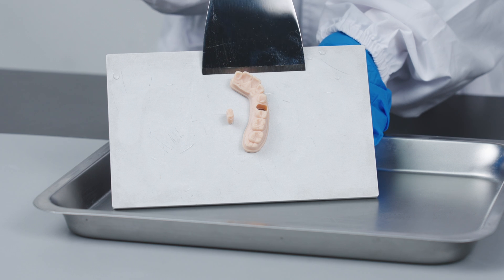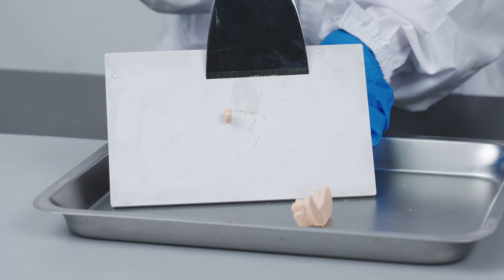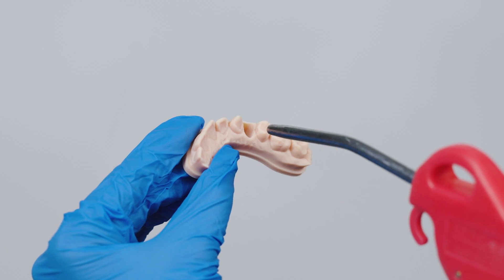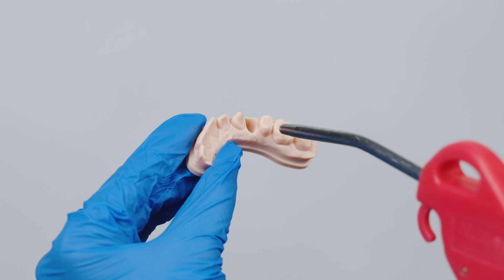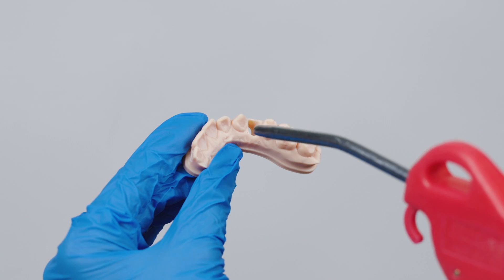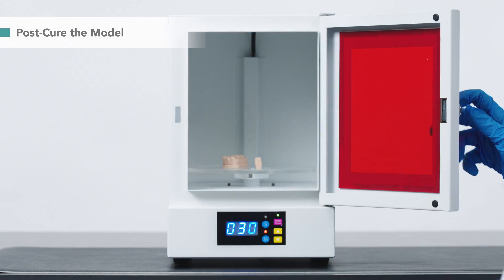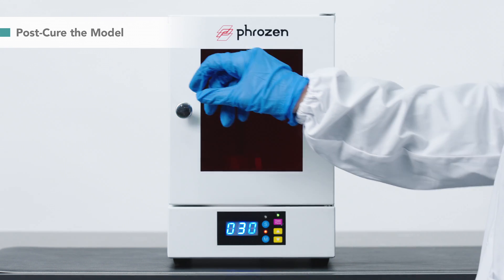After cleaning, let's remove our models from the building plate. Use a compressed air gun or simply keep it in the dark for 30 minutes to dry the model. To increase model strength and stability, we post-cure it with a UV cure station for 30 minutes.